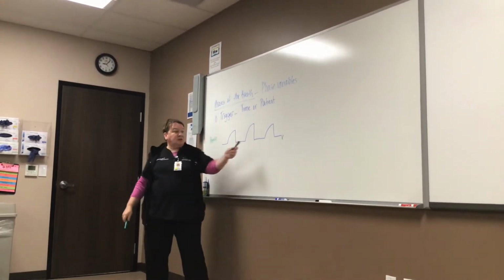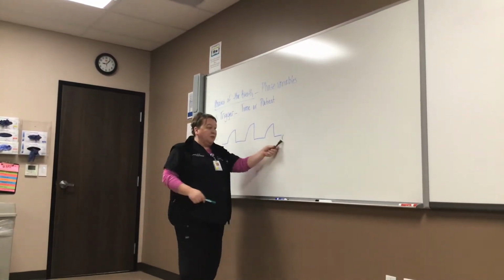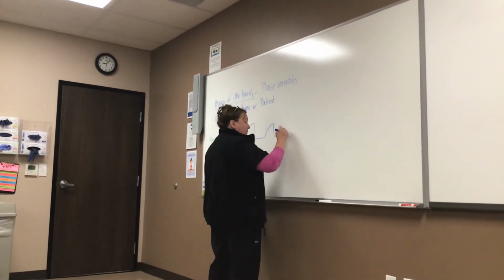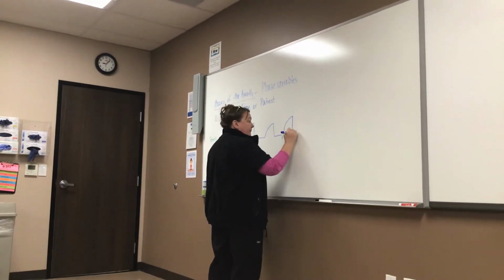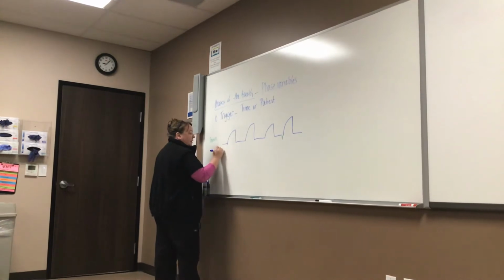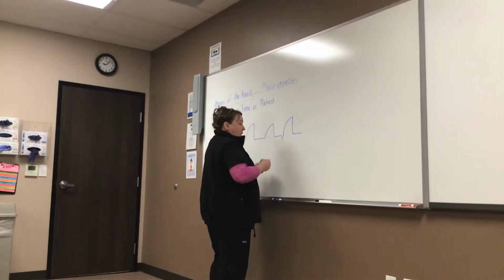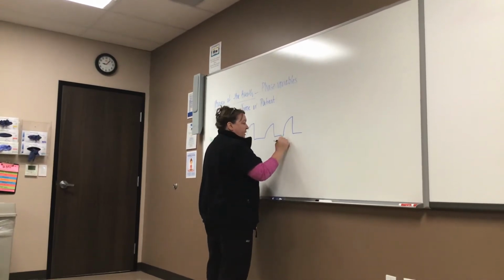Because if it was patient-triggered, what would it do? Go negative. So the patient-triggered breath, you'll see this little dip in it. So we know that these are all time, and where you see the little negative drop, that's a patient.